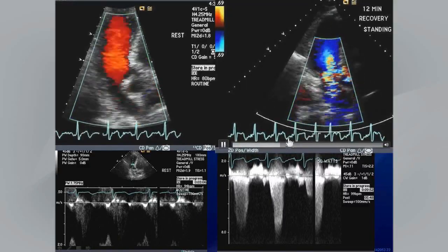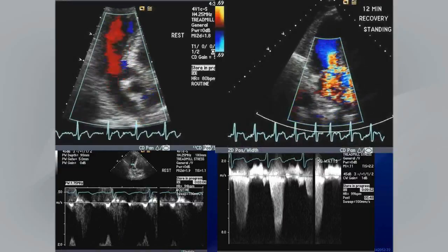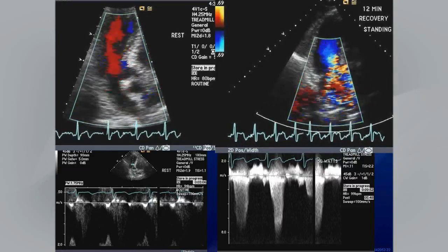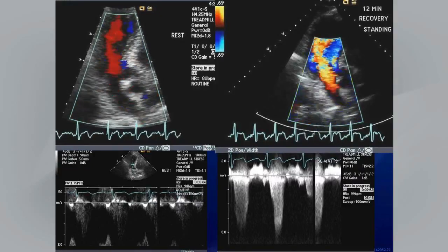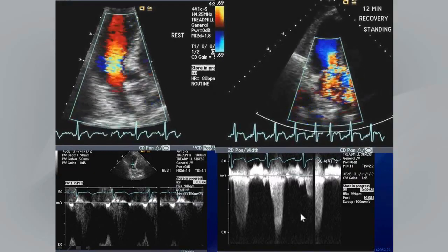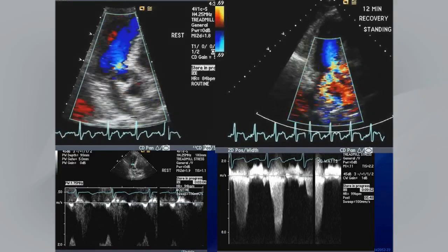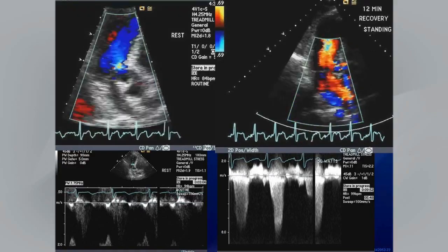But with the stress of exercise, we did our usual stress echo, had the patient lie down, and the patient said, I get the symptoms if I stand up. So we had the patient stand up right then after stopping exercise, and you can see that there's significant mitral regurgitation that develops. The dynamic obstruction appears worse, and this really offers a nice explanation for the patient's symptoms, although you can see that the mitral regurgitation and the left ventricular outflow signals are somewhat blended in this Doppler profile.